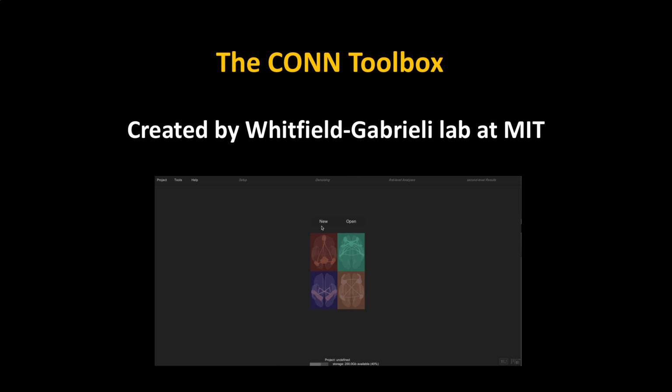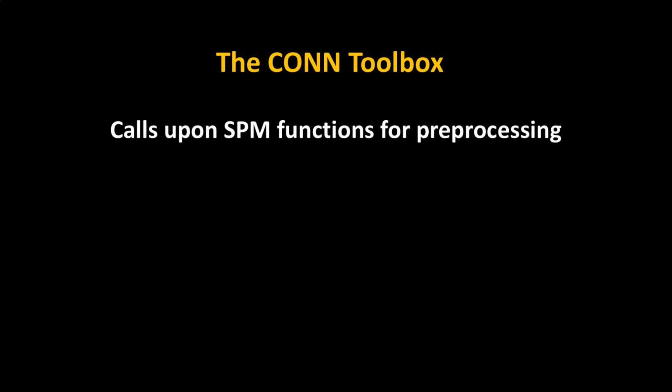Now everybody else, including CONN toolbox, uses first level to describe analyzing everything for the single subject. And then second level is group results. Just wanted to make that clear in case there's any proactive interference in your memory. I used the psychological term, wow.